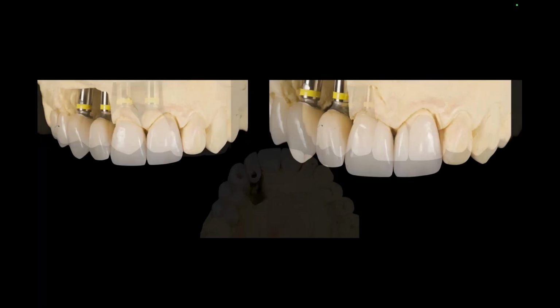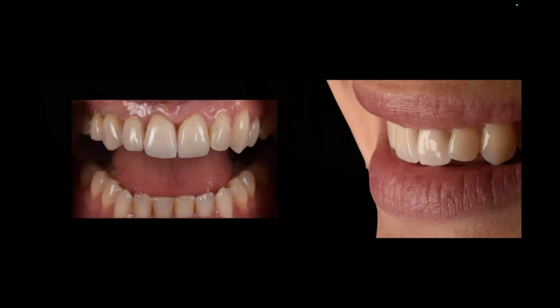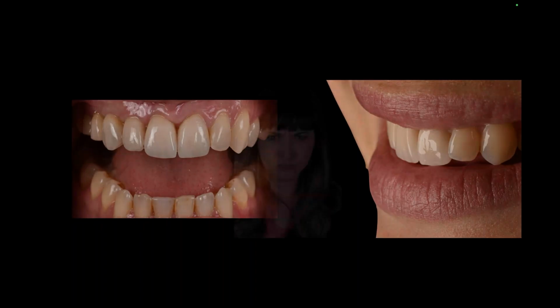It's kind of a combination, implant and full coverage. Here we go on the insert, and you can see that kind of blends pretty nicely. The difference between full coverage and then implants into what nature is, which is she wanted everything to look kind of natural, which is great. Right, so we finished off her case, and she has her normal happy smile back again.